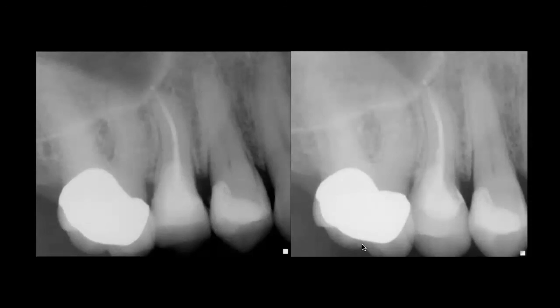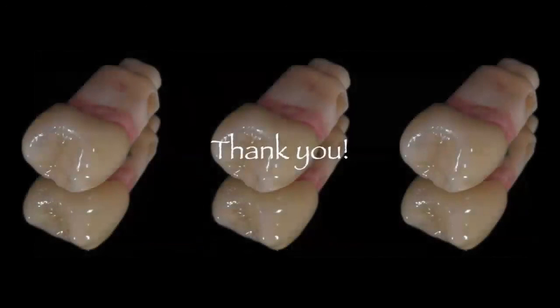And then this is the PA, the periapical x-ray. Again, you're seeing here now the completed, the final restoration, fully seated, bonded. Everything is nice and clean. Everything is nice and uniform. One solid buildup with the fiber reinforcement. And again, you're seeing this little shadow here. That is the fiber on that neighboring tooth that I also placed in that axial wall when I was restoring that premolar. So this was my last photo.